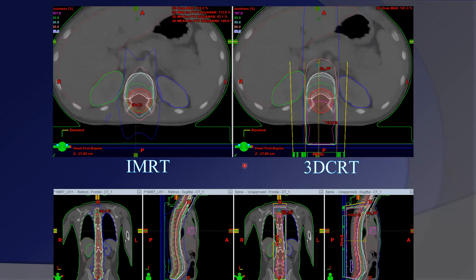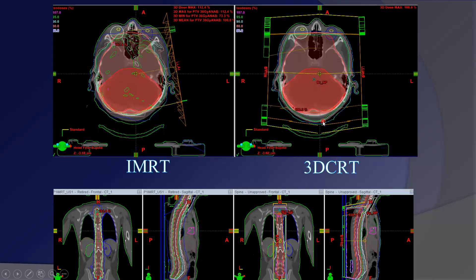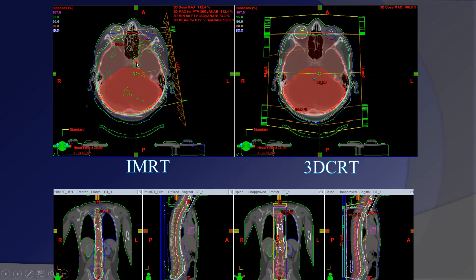For plan evaluation, you can compare both plans. In the IMRT plan, skin sparing is achieved, whereas in 3D CRT higher doses are delivered to the skin. IMRT produces inhomogeneous dose distribution in some areas but spares the lens, while 3D CRT gives a more homogeneous dose distribution but results in higher dose to the lens. If coverage of certain areas is required, lens dose will be exceeded in 3D CRT, whereas with IMRT it can be reduced as much as possible.